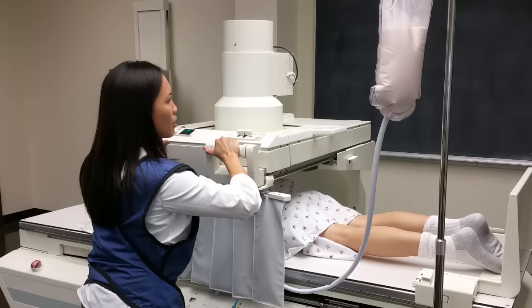If an abnormality is seen while barium is filling the colon, take a spot radiograph. Once barium reaches the middle of the transverse colon, the enema bag is gently lowered to the floor and the rectum is drained by gravity. Make sure you don't clear the entire rectosigmoid colon of barium, because we need enough barium within the colon to coat the entire mucosa and also fill the ascending colon. The small amount is cleared from the rectum to make sure there aren't pools of barium that might obscure lesions. The bag is then clamped and air is put into the colon to complete this portion of the exam.